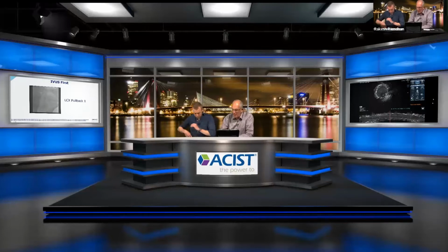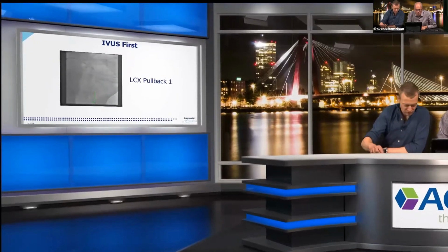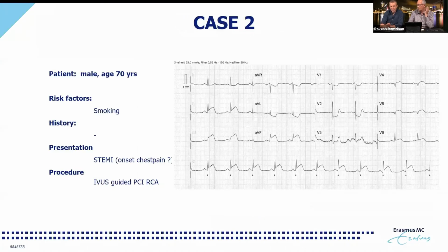All right, so case 2, if you go back to the slides, we'll present you case 2. It's a 70-year-old male patient, also an active smoker, presenting also with a STEMI. Time of onset of chest pain is not clear. By the way, this was the final result of the previous case. So case 2: active smoker, 70 years old, presenting with a STEMI, again ST segment elevation in the inferior leads in this case, which fitted with an occlusion of the right coronary artery, which we'll show to you.